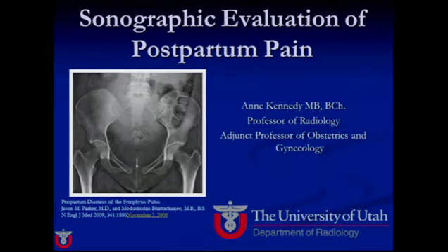First things first, you may wonder why there's an X-ray on the first slide of a talk about the sonographic evaluation of postpartum pain. However, I think it's important to remember that many people who've had a baby have musculoskeletal or myofascial pain, and we can't always figure that out on ultrasound. So in patients in whom you find nothing sonographic, it's worth remembering that there are other causes.